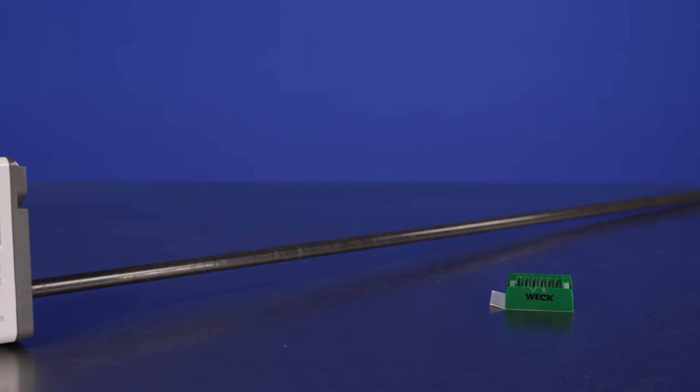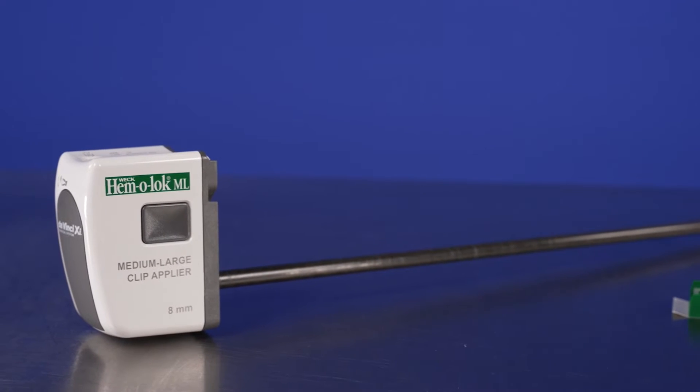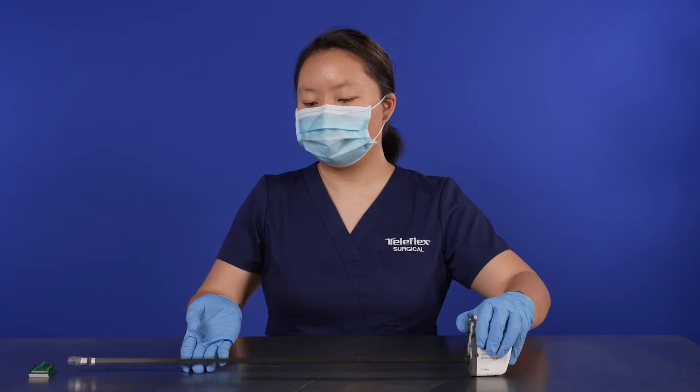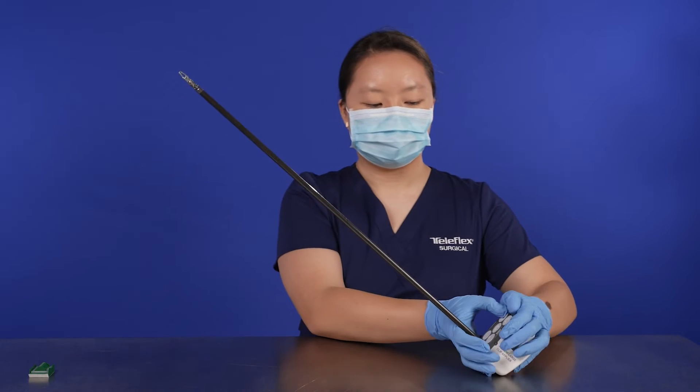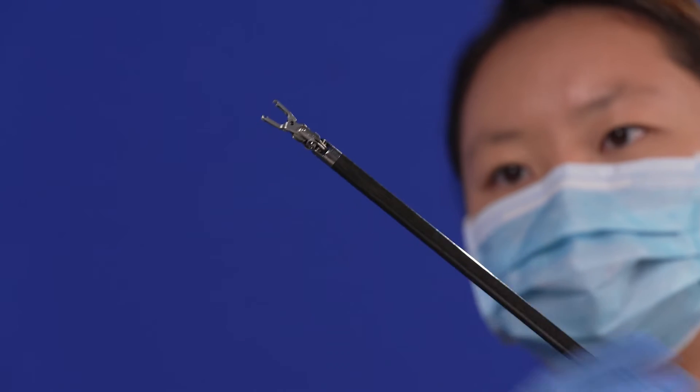To use the DaVinci XI Endo Wrist Medium Large Clip Applier, a sterile OR staff member must load a clip into the instrument. With the instrument housing resting on the table, hold the instrument shaft at a 45 degree angle from the table. Open the instrument jaws by rotating the housing discs clockwise.